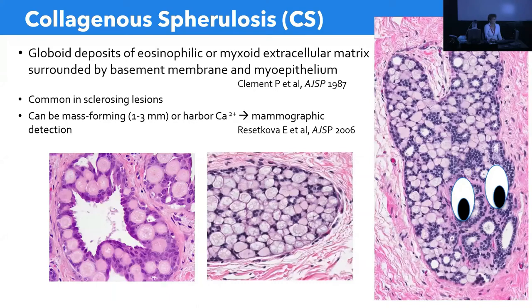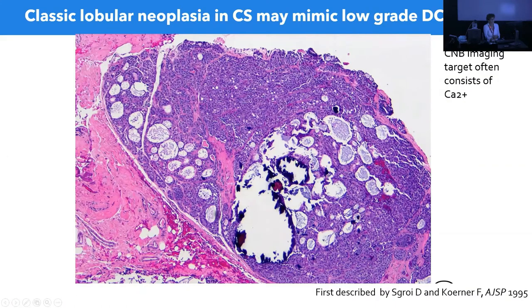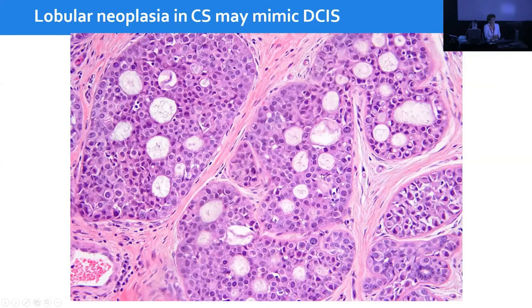Here is an example of collagenous spherulosis with a lot of calcifications that at low power may mimic a case of low-grade DCIS. Notice the monotonous proliferation and pseudocribriform spaces. This is collagenous spherulosis involved by classic lobular neoplasia, mimicking low-grade ductal carcinoma in situ. Sometimes the nuclei can even show some more atypia. How do we sort out these cases?